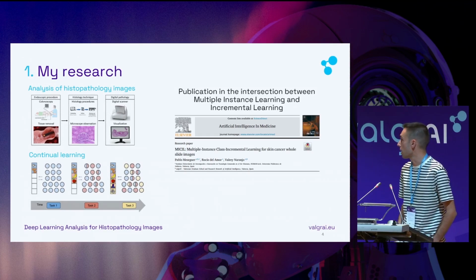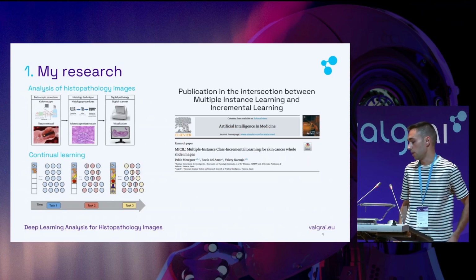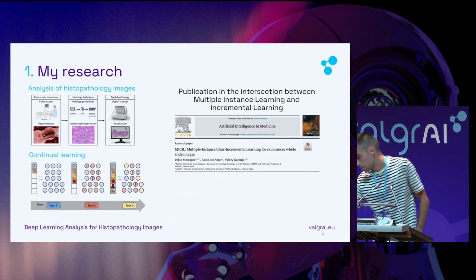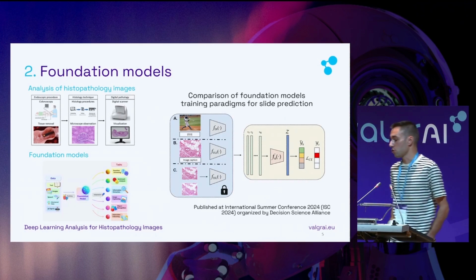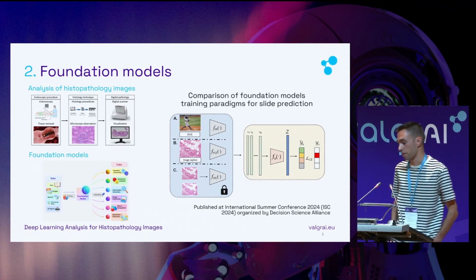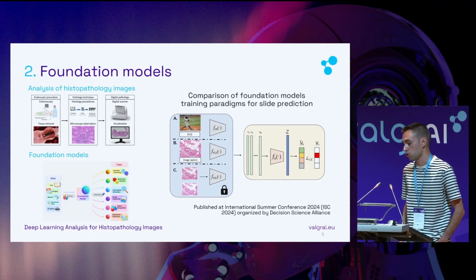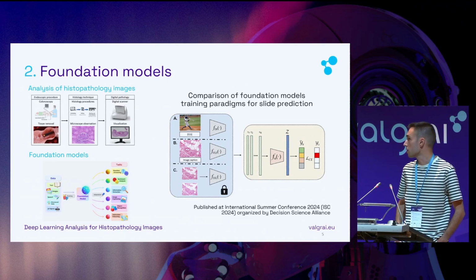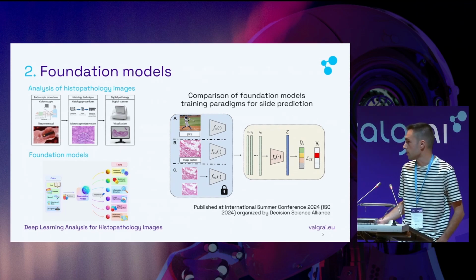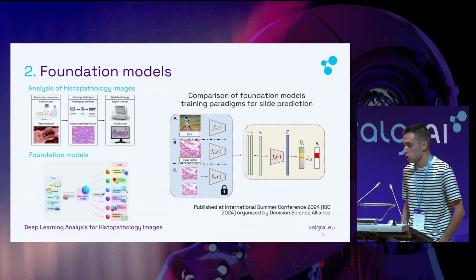So what we applied is a multiple instance learning-based method for the classification of whole slide images in a continual learning framework for the prediction of different subtypes of skin cancer. Later, the investigation shifted to foundation models, which are a kind of models that know about everything. They can do any kind of task because of their pre-training, which is based on multi-modalities and very large and extensive datasets. The pre-training is mostly performed in an unsupervised or self-supervised manner, or with a novel paradigm, which is vision-language supervision.